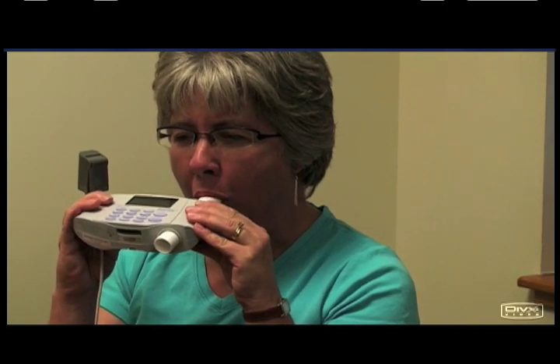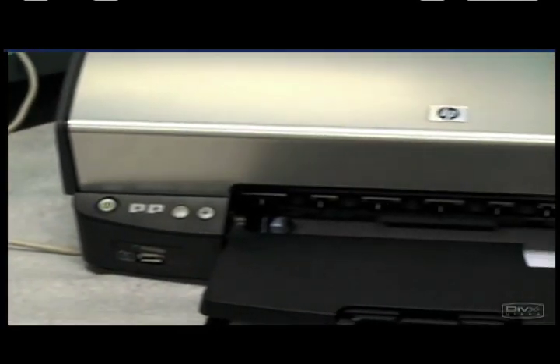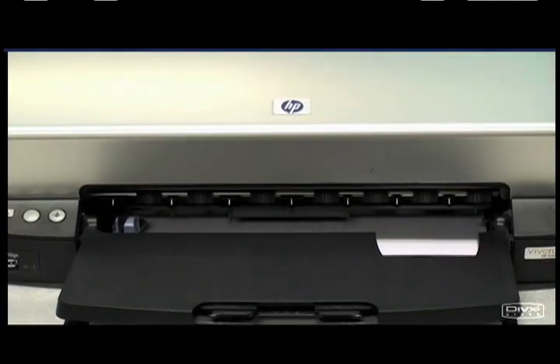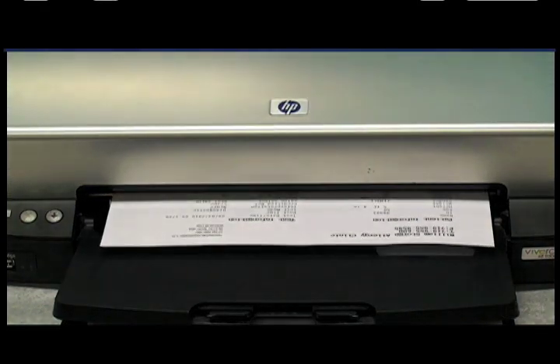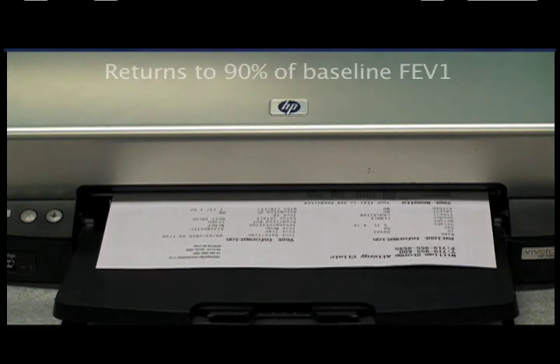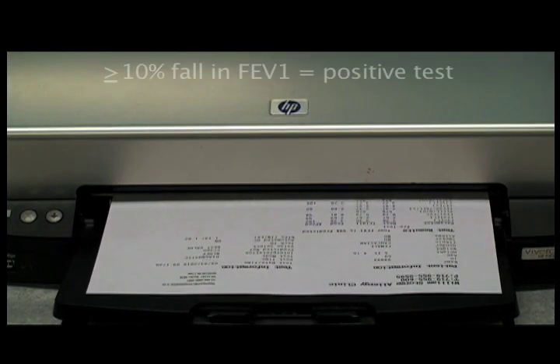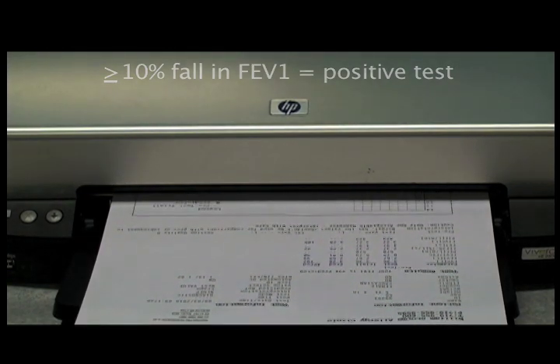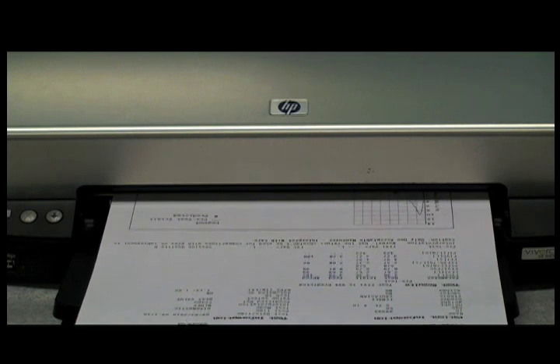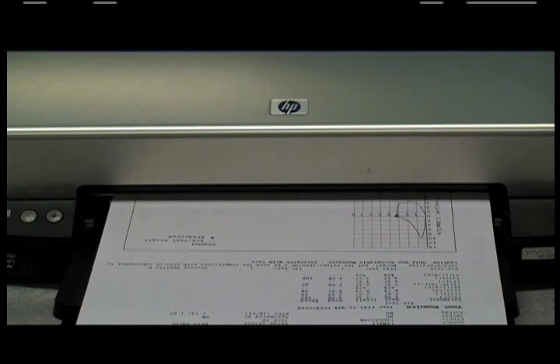Now, following the 6 minutes of breathing, the subject performs post-challenge spirometry at 1, 3, 5, and 10 minutes, which is examined to determine if there is a fall in FEV1. The patient can then be treated with rescue albuterol until the FEV1 returns to at or above 90% of the baseline FEV1. It should be reiterated that EVH should never be performed on a patient who has an FEV1 below 70% of predicted, and only with caution in a patient with an FEV1 below 80% of predicted because of the risk of a serious fall in FEV1.